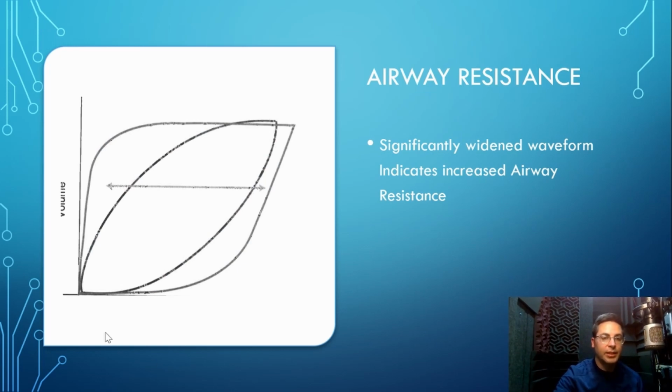Okay, when we see this here, we see some issues. In the center here, we have a fairly typical pressure volume loop here, but we're looking at this other loop here. We see substantial gains in pressure without substantial gains in volume up into a certain point where we have a rapid rise. And then on the other side, we see substantial decreases in pressure before we see significant decreases in volume, indicating expiratory resistance on this side and inspiratory resistance on this side.